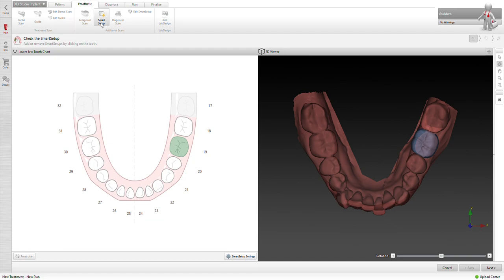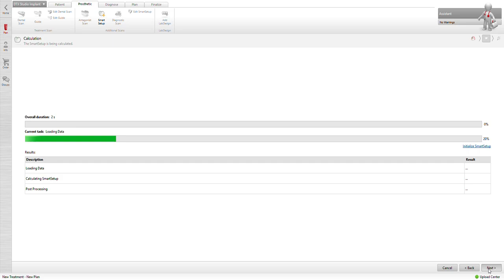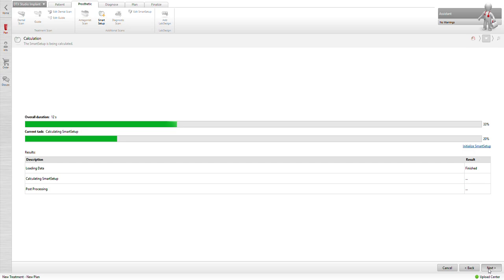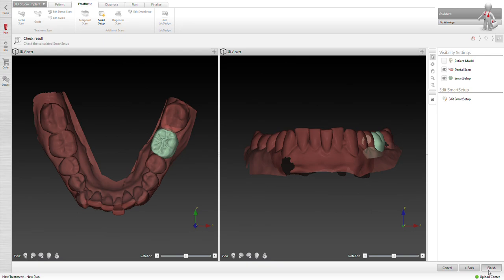Okay, happy with that. Going to go ahead and then hit prosthetic. We're going to do Smart Setup. It's going to go ahead and put a virtual tooth in there that's a little bit more accurate than the wax-up. This again is not perfect, but it gives us a guideline and positioning of our implant so it gives us an optimal restorative and aesthetic outcome.